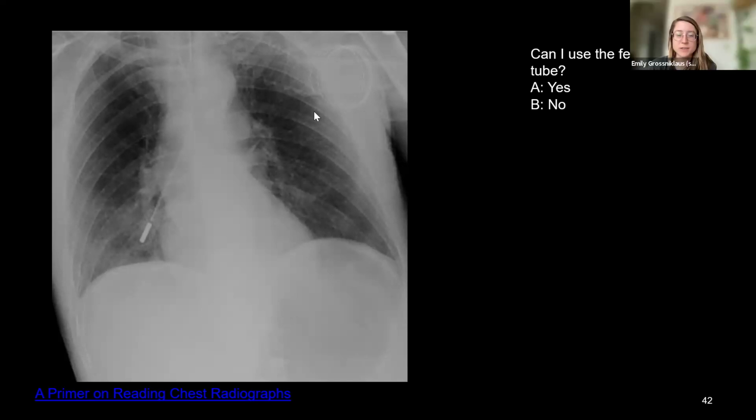We're getting some good results on this one. Okay, excellent.